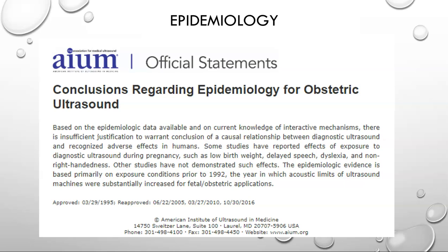The AIUM official statement on epidemiology for obstetric ultrasound concludes that the epidemiological evidence based on exposure is based on conditions prior to 1992, and there is insufficient justification to warrant conclusion of a causal relationship between diagnostic ultrasound and adverse effects in humans. So basically, we haven't seen any problems yet. And then they make the caveat that this was done prior to 1992, when the limits of ultrasound were raised substantially. In fact, they were raised 10 times.